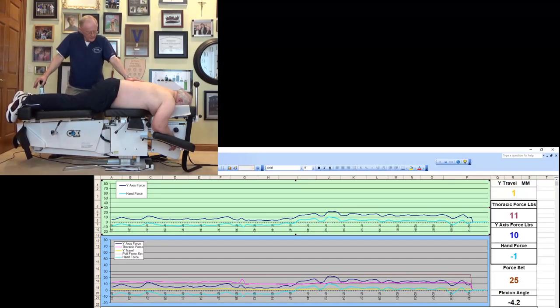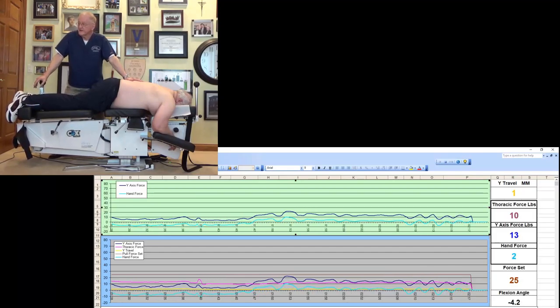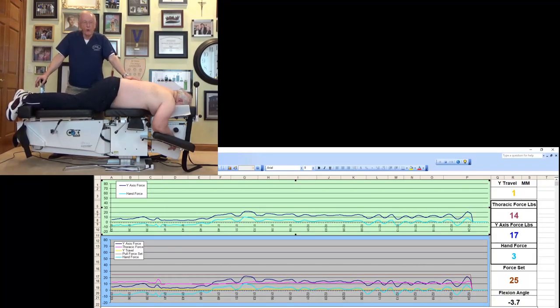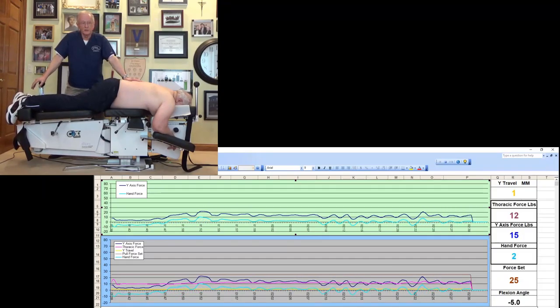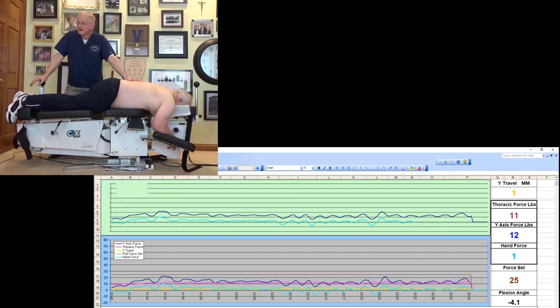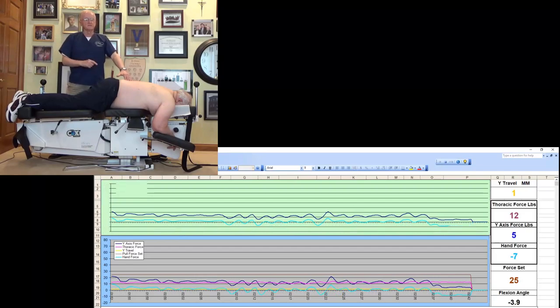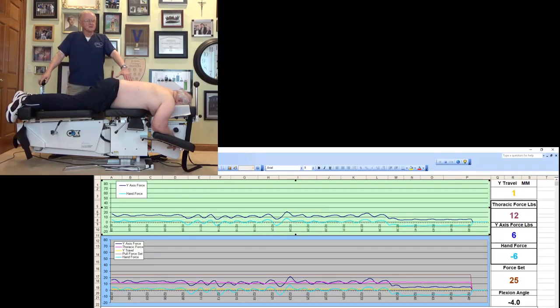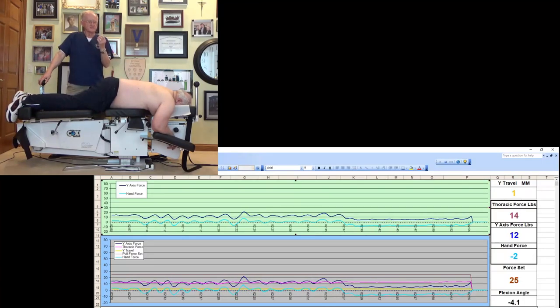So I'm applying about two pounds of tolerance testing per segment. And I move from L1, two, three, four, and you can see the sine wave showing my force application. And I move all the way down to L4, which is where I'm going to apply the treatment of this particular condition of L4 degenerative stenosis and acute L5-S1 disc prolapse. By tolerance test, rarely will a patient say at two pounds of tolerance testing that they feel anything. What do they typically say? No, doc, it just feels good to be pulled apart. The lowest force that gives clinical relief is where we start. And if it works, you don't have to go any heavier.